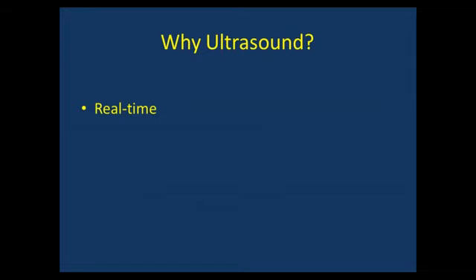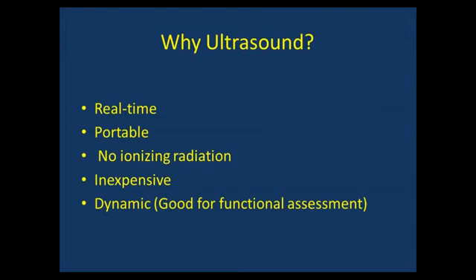But why ultrasound? It is real-time, portable, no ionizing radiation compared to X-ray, inexpensive or relatively inexpensive, dynamic, so good for functional assessment. You can assess the difference between inspiration and expiration in sick infants, and you can get an impression about lung collapse at end of expiration, for example.